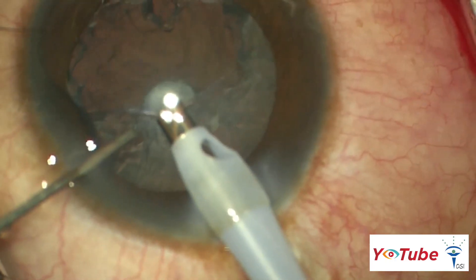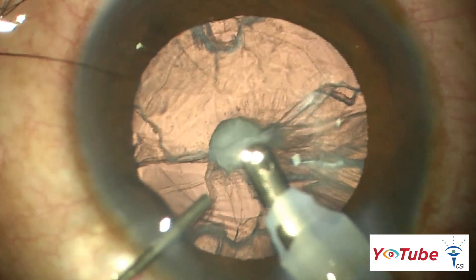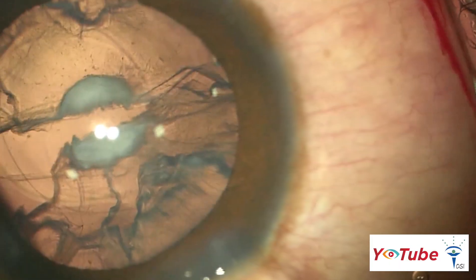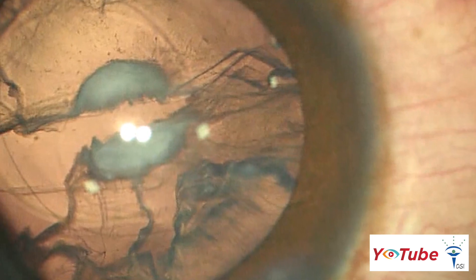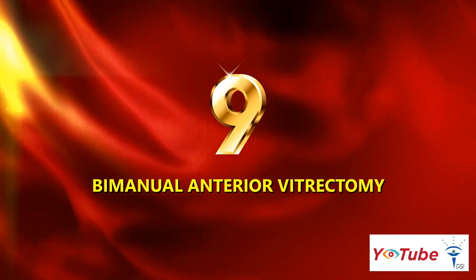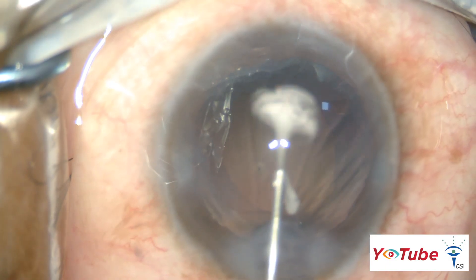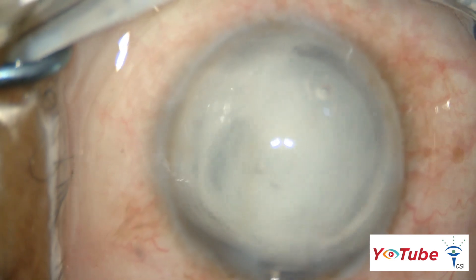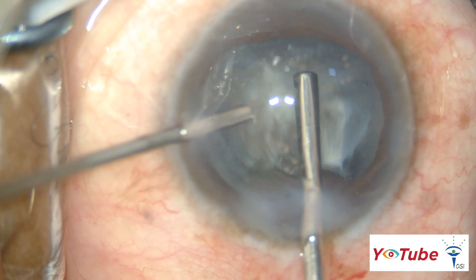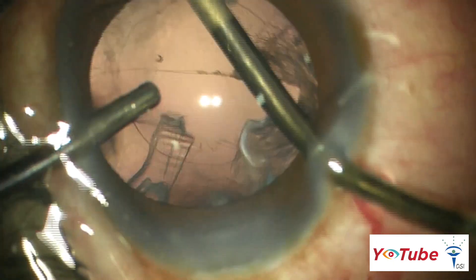In the event of a posterior capsule rupture, dispersive viscoelastic should be injected from the side port to coat the rent before withdrawing the phaco probe tip from the eye. This helps in tamponading the vitreous and preventing its entry into the anterior chamber. The infusion bottle should be lowered and a bimanual vitrectomy with or without triamcinolone, with low suction and high cutting rate, should be done for removing vitreous completely. A bimanual irrigation and aspiration should then be done for removing any residual cortex.